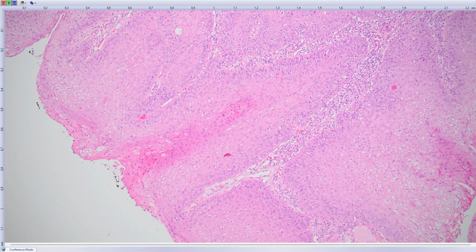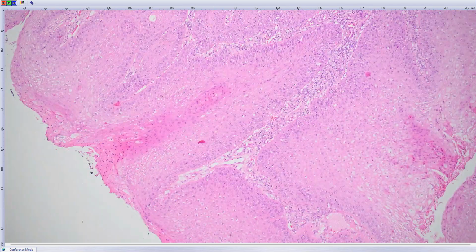It's recurrent, it's big, it's obturating the oral cavity or larynx, and they agreed that it's a bad kind of keratosis, and eventually published probably 22 cases of verrucous carcinoma. So that's the beginning of the story of verrucous carcinoma.